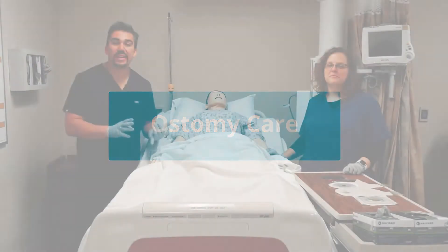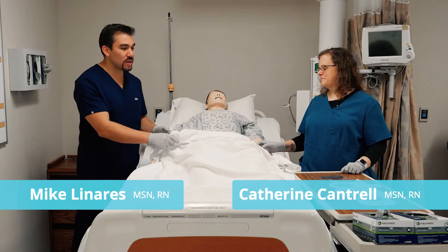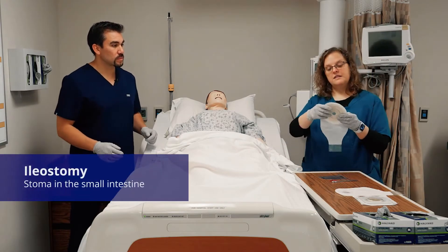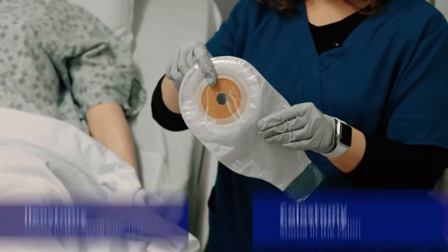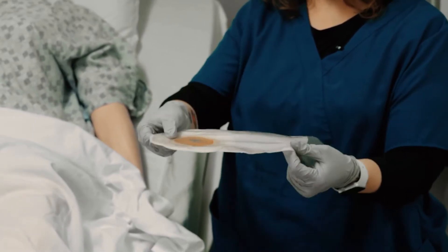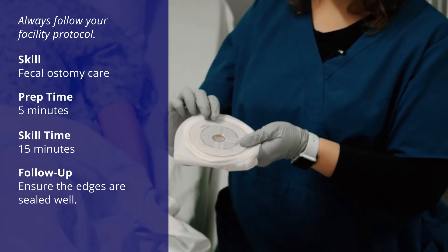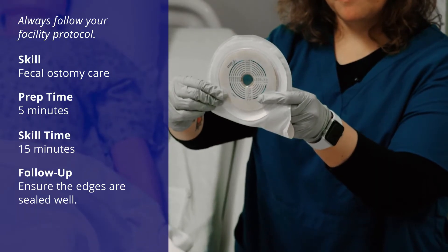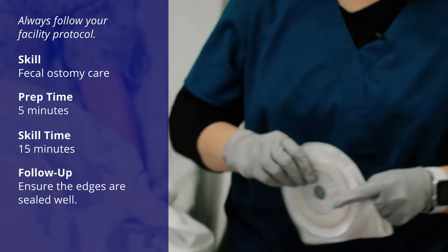For ostomy care, we're going to cover both ileostomy and colostomy. What we have is an already put together ostomy — it's got the bag and the wafer, and these come as one unit. They already have the little diameter marks on them so that you can measure up your bullseye and make sure that you've got the right size.